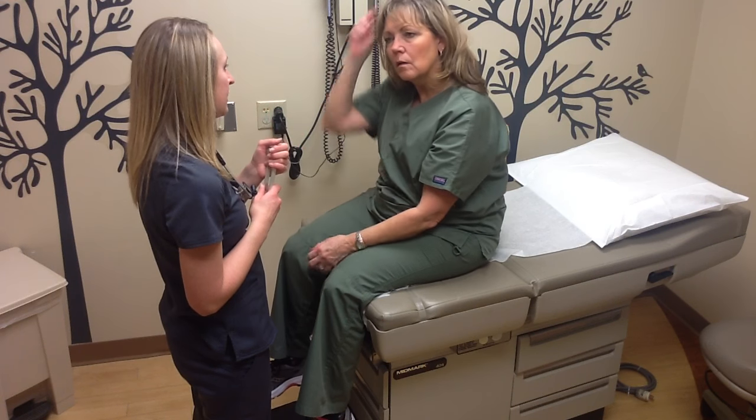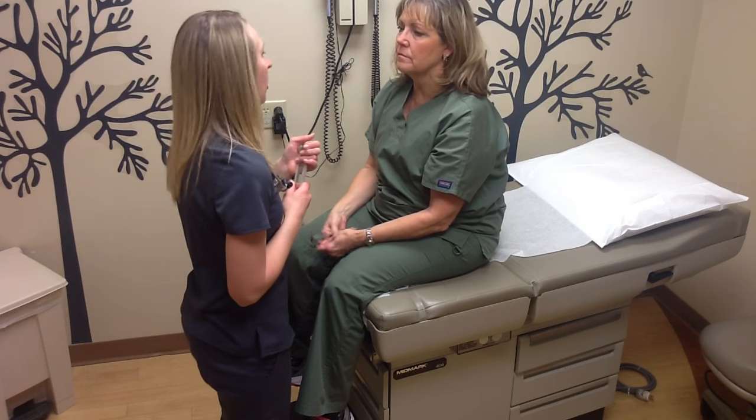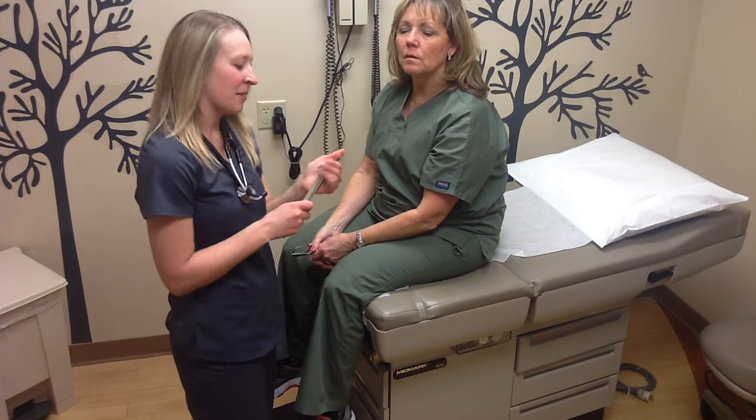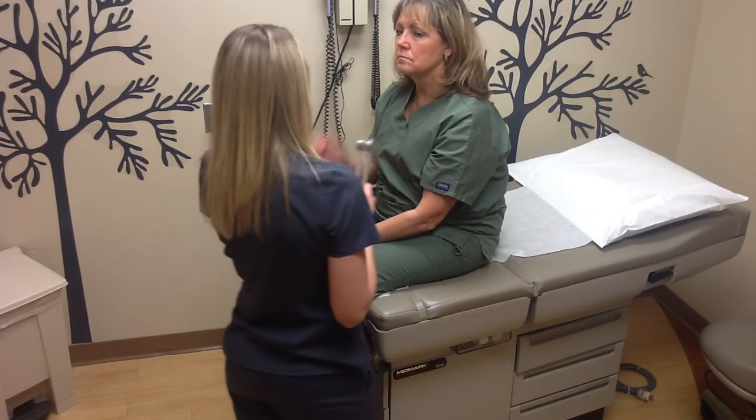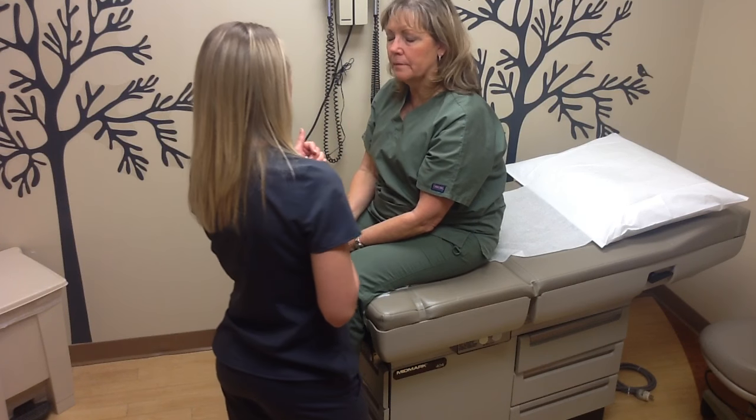You can go ahead and put your glasses back on here. That's good. Okay. Next, I'm going to put this on top of your head. I want you to let me know when you can't hear the vibration anymore. Okay.